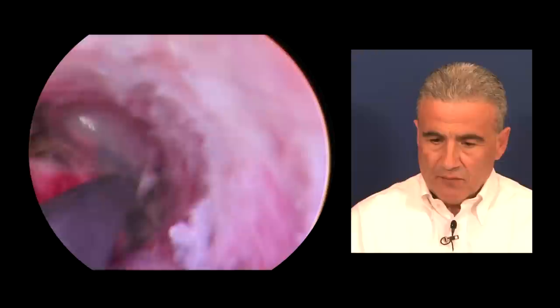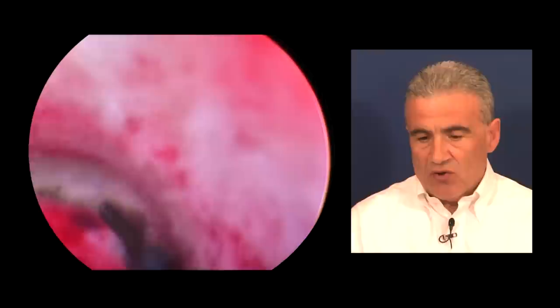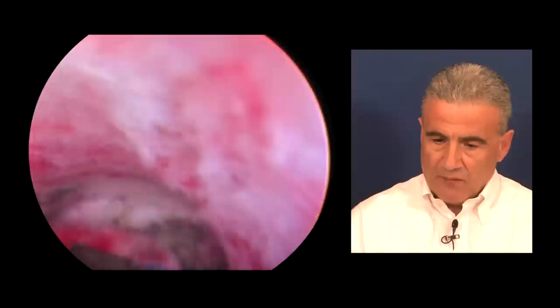In this case there will also be the advantage of having a complete histological diagnosis on the polyp in its entirety, without having to reduce it into small fragments. We observe that the polyp has been almost completely detached, with a small residual fibrous area remaining in the insertion area.